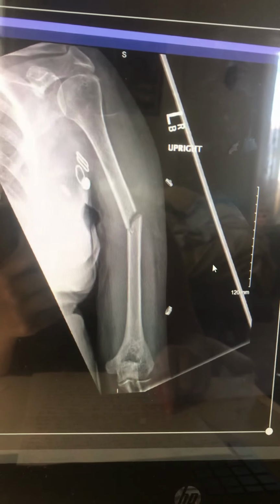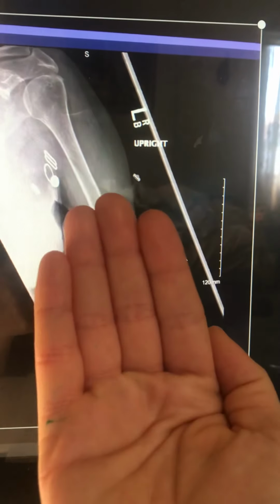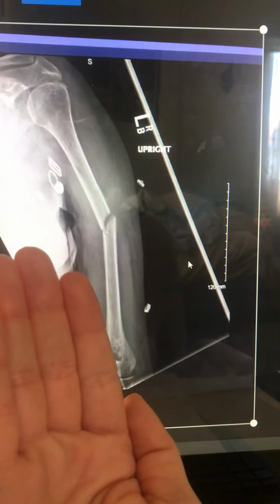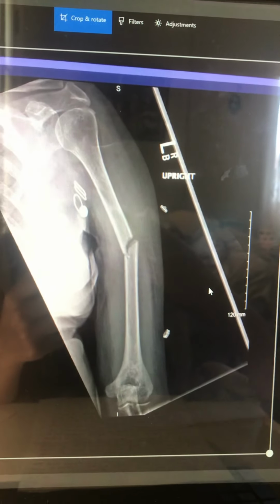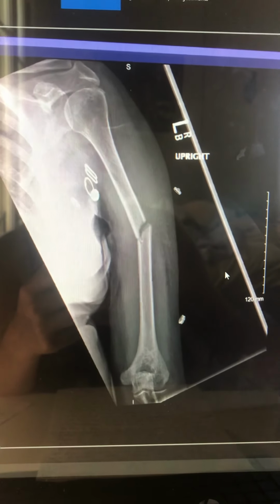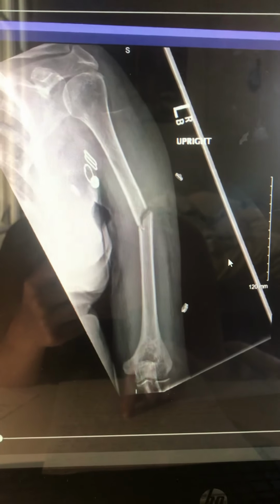So her body, she's standing, was slightly angled out like that, because we didn't move the CR and because it was done with the upright bucky. So we didn't put an angle on that. We just moved her body.